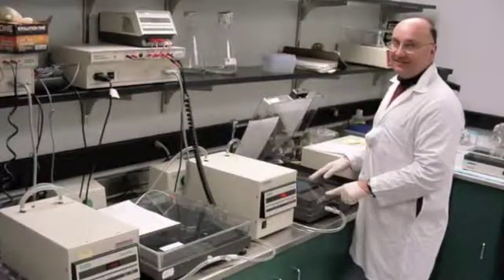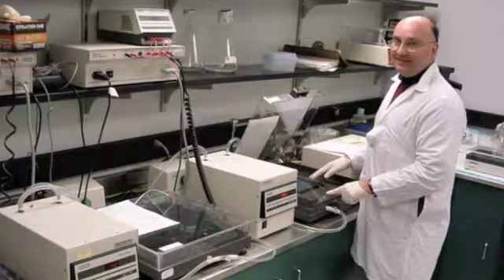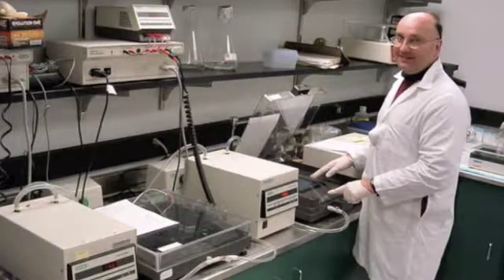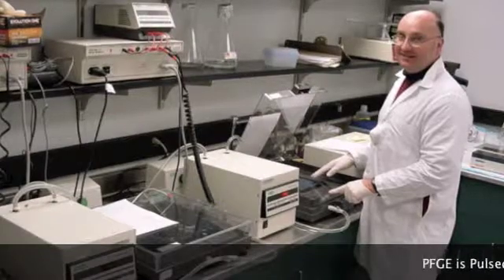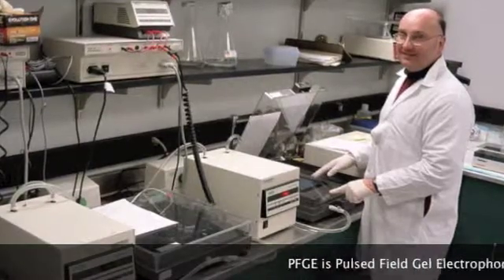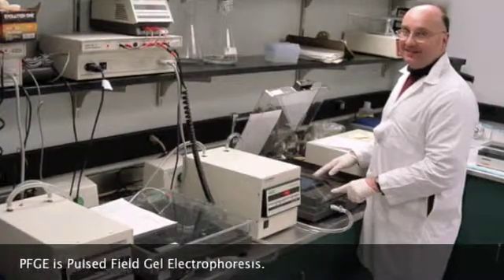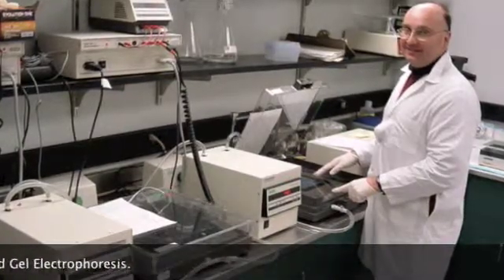Hello, my name is Mr. Postfield. I am a scientist at the State Public Health Laboratory. Today I'm going to show you how we perform pulsed field gel electrophoresis, known as PFGE. Scientists use PFGE to quickly identify bad bacteria in food so we can stop it from making people sick. Come on, let's go into the lab!